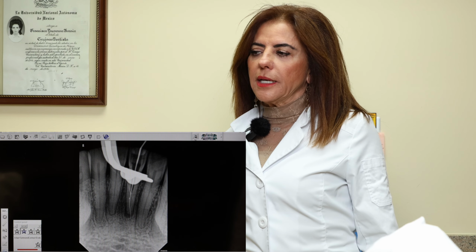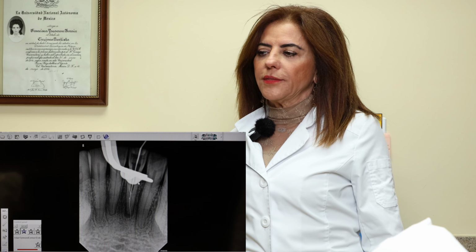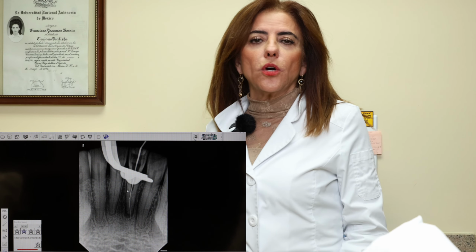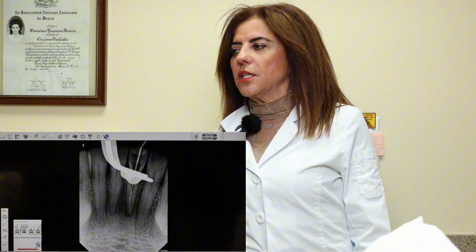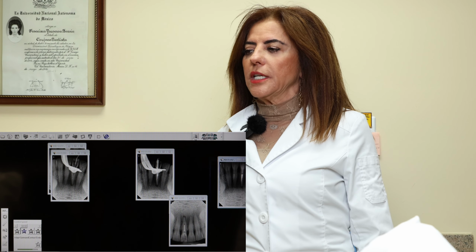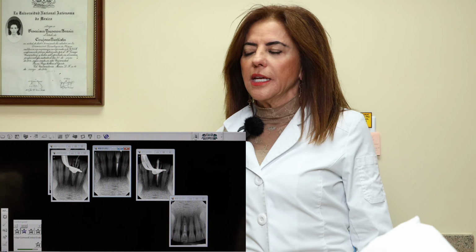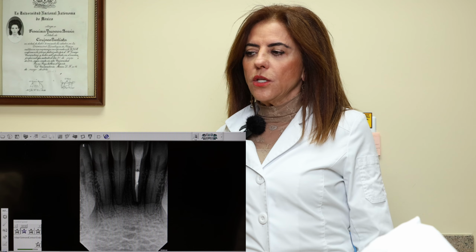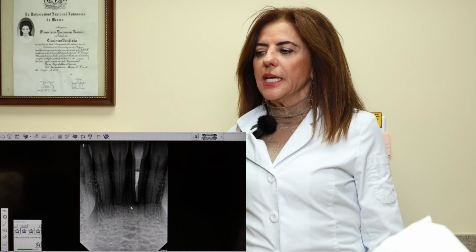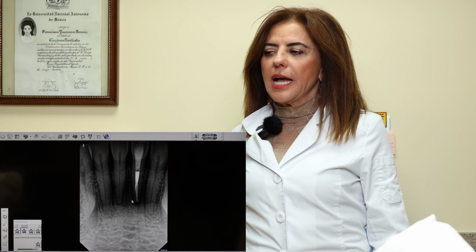And we spent a couple of hours, but look at this image when I was very excited. Unfortunately, you have to destroy more of the walls of the tooth, but this is just more technology. But for you, know that there could be times that you get to the endodontist and you're going to have a calcification on the tooth, and that calcification is going to take a lot of time, because if the tooth is infected, you have to disinfect everything. I love the results. She was very satisfied. She's very happy. We saw her recently. I don't have an x-ray to show you right now, but this black area that is here has disappeared.